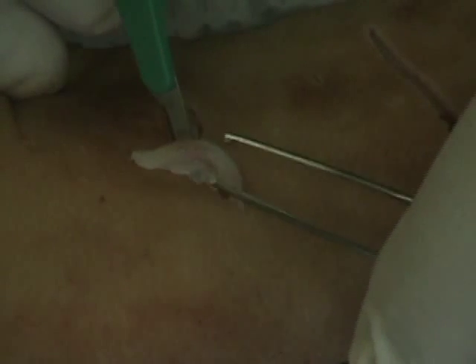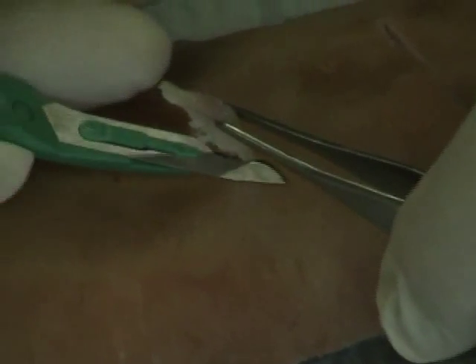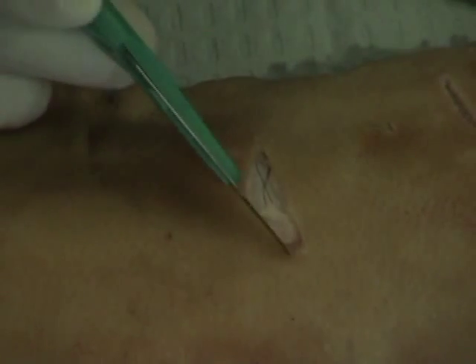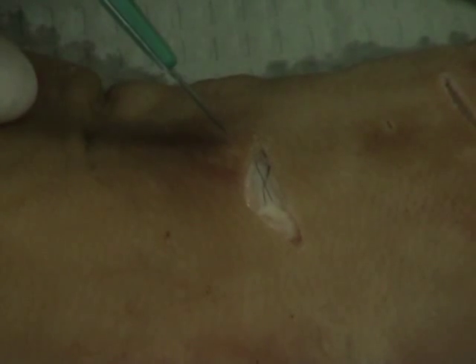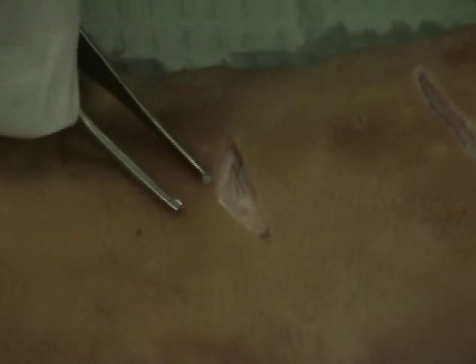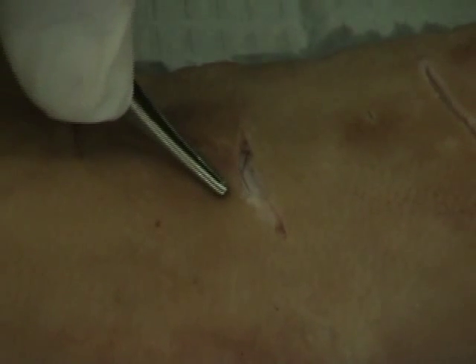Okay, and now as I go to close this up, depending upon how I actually close this up, I can accentuate to some degree. I'm going to lose some of this curvature, but you can see this side is curved and this is close to the skin lines. When I close this up, I can actually close this up in a manner that's going to tend to allow this curvature to remain as much as possible. And what I can do is if I'm fairly close to the curvature here, when I undermine, I'm going to keep this side without undermining this side, and just undermine on this side, which then will have the tendency of pulling this side more easily this direction and minimizing the pull downward, which would flatten the curve on this side.